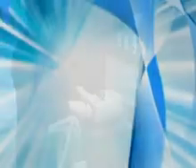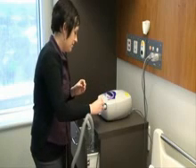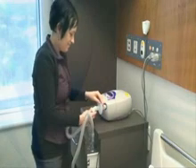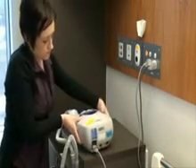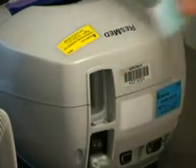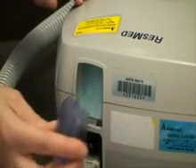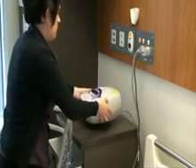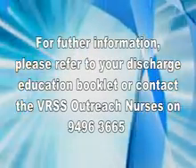Monthly Tasks. The SureGuard filter is fitted to prevent water from accidentally spilling into the ventilator causing damage. Change the filter monthly or if wet — it is disposable and cannot be washed. Replace with a new SureGuard filter. Three to six monthly tasks: the ventilator dust filter is located at the back of the machine and should be replaced approximately every three months. To change, remove the filter cover on the back of the machine. Remove and dispose of the old dust filter and insert a new filter with the blue tinted side facing outwards. Replace the air filter cover. For further information, please refer to your discharge education booklet or contact the VRSS Outreach Nurses.